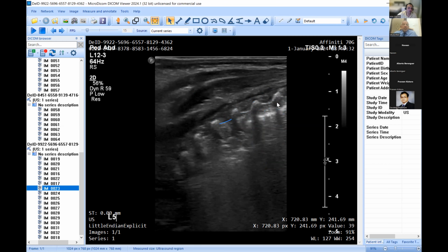Now, next, what would you describe after that, pleura? I can't comment on the sliding. The pleura appears to be okay. I wouldn't say it's massively thickened. I can't point here, but just below the pleura, that white appearance, I don't know what that is. Can you see pleura? Can you see a defined white line anywhere? Yeah, the white line. I thought that was the pleura. I thought where you pointed out was pleura, but I can't see it elsewhere.